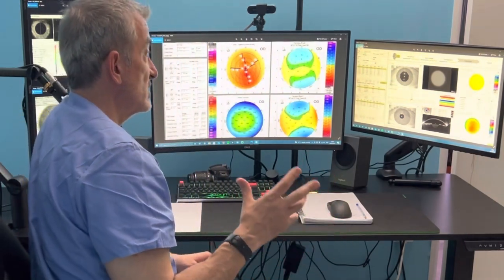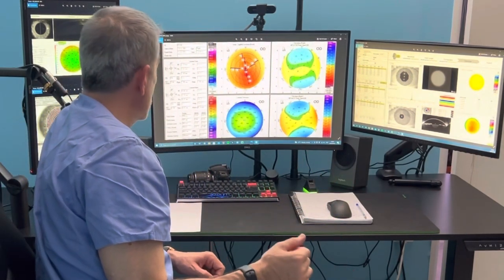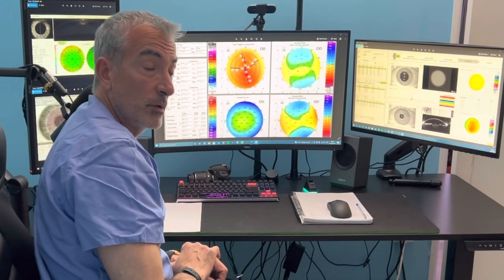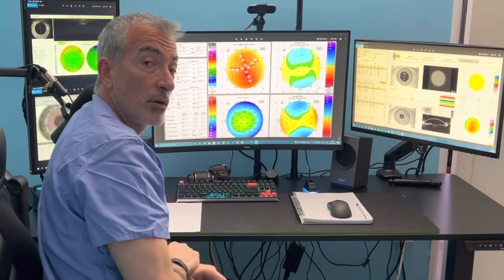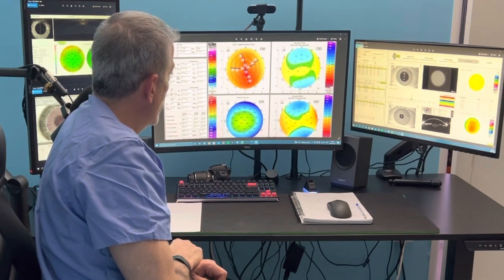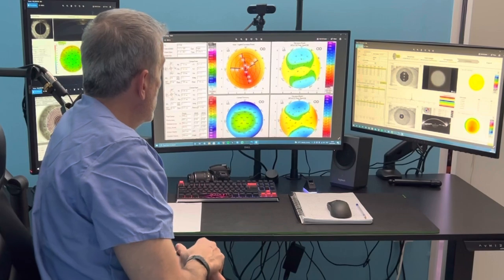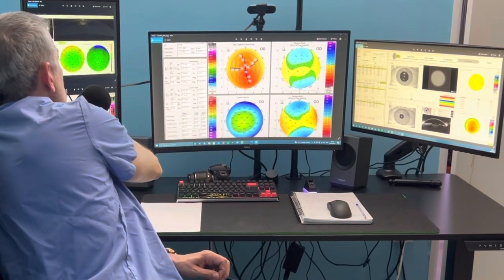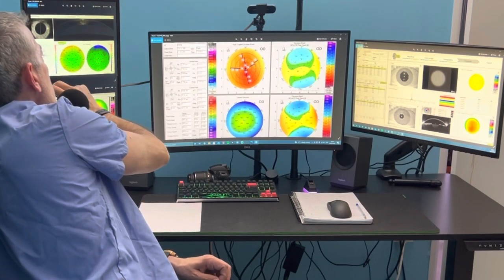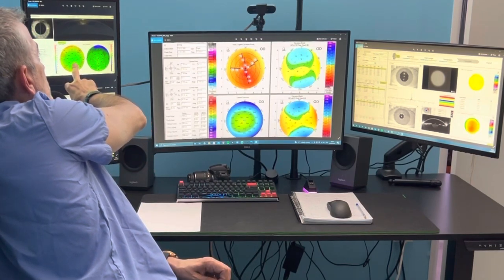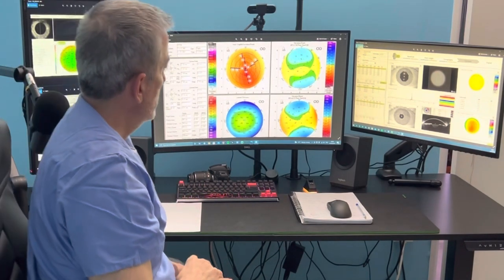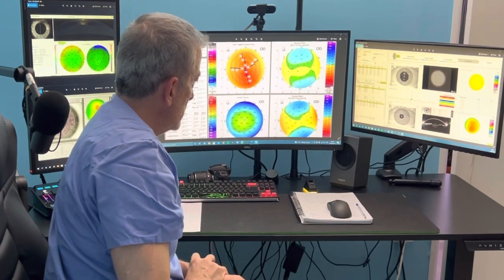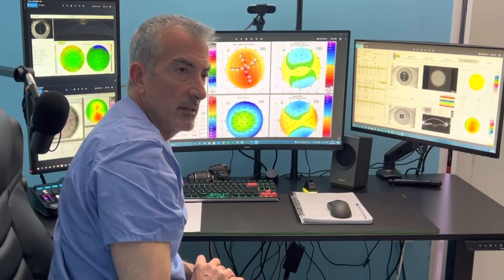In this particular patient — a 30-year-old female in Greece with minus 2 diopters of myopia — we decided to go with PRK, given that one in ten patients in Greece has documented keratoconus when we look at our cataract patients over the last five years. The fact that it's low myopia and looks a little suspicious, and that in the OCT-derived maps the thickness is not well-centered and has multiple steps, makes us consider that she would probably do better with PRK.